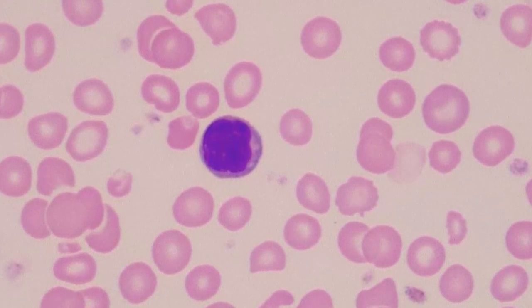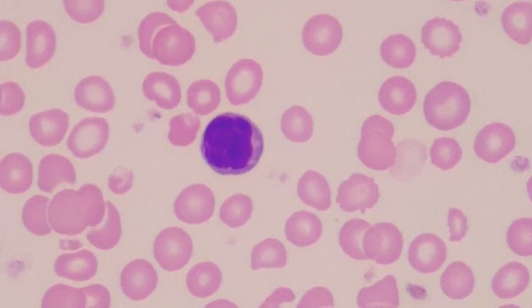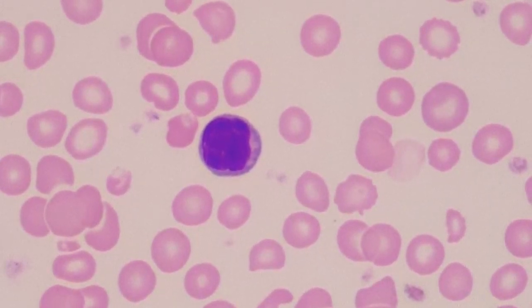And when it comes to judging red cell size, I always like to use white blood cells, and specifically I like to use small lymphocytes. So here we have a small lymphocyte right in the center, and typically a red blood cell can easily fit within a small lymphocyte. So looking at the lymphocyte in the very center, I would say at about like 7 o'clock, meaning to the bottom and to the left, we can see a red cell that looks pretty normocytic, meaning normal in size. But if we look at 6 o'clock, we can see one that's slightly smaller.